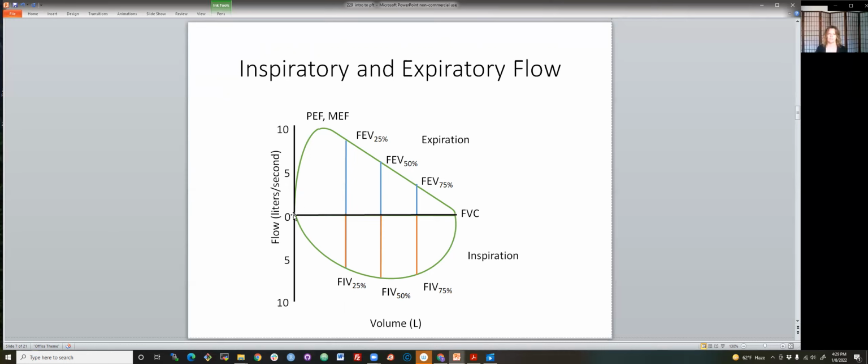At the peak of inspiration, I'm going to exhale. And you can see that at the beginning of expiration, that flow rate is significantly higher than the rest of the expiratory time. When we're looking at the inspiratory shape, it's more dome shaped. So we are basically splitting that in half with equal flow rate on each side of the peak.